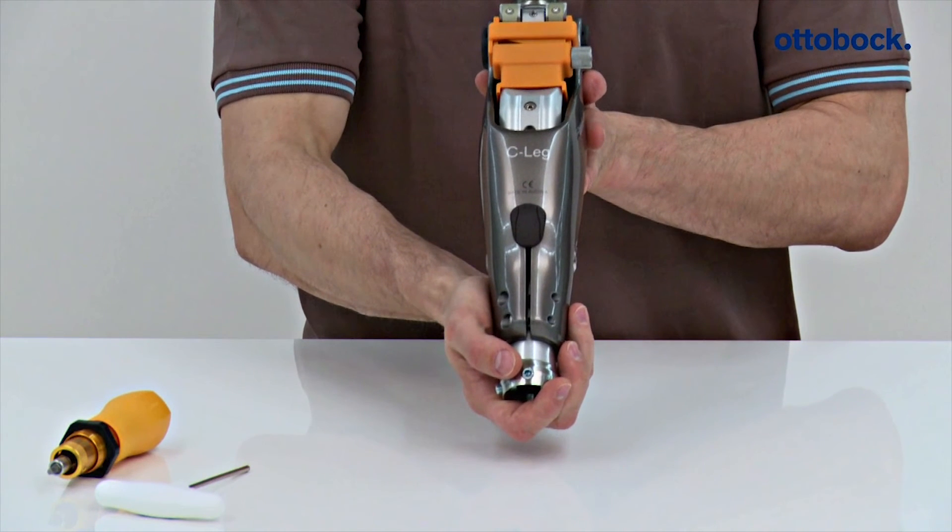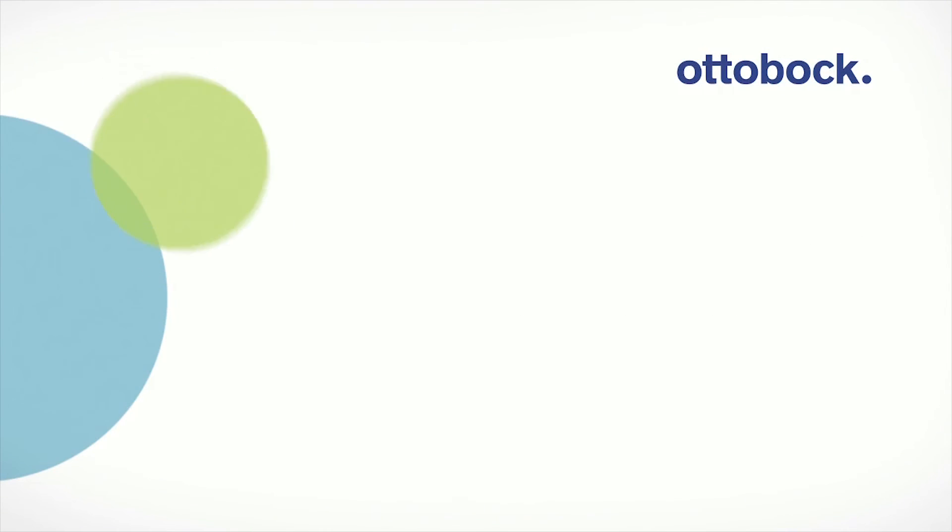During bench alignment, the knee extender has to stay in the joint.